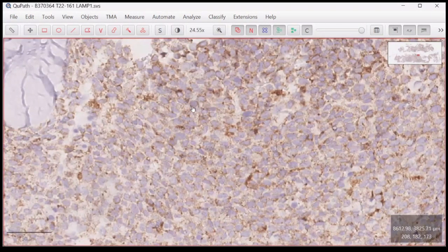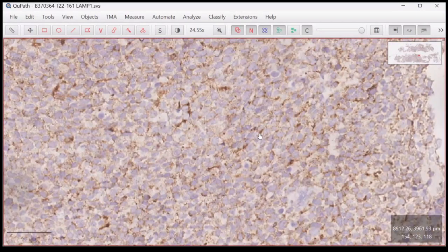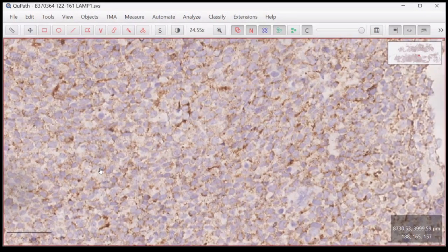So okay, this again just indicates that most of these cells are of the monocytic series. So this is M5, and the trephine biopsy cannot subdivide whether this is M5A or M5B. What we know is this is AML M5.